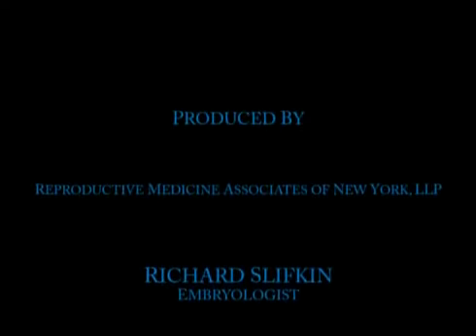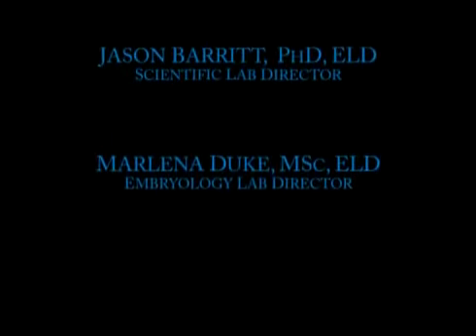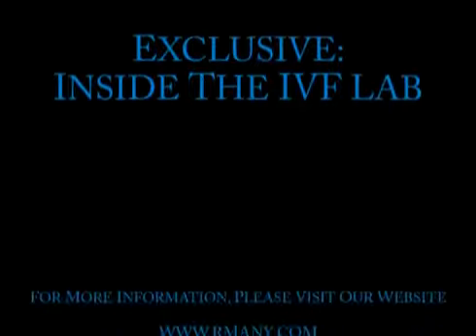We hope you have enjoyed this short tour of our laboratory. The embryologists at RMA of New York take great pride in every procedure, and we hope this video helps you understand the care that we put forth in helping you achieve your dreams.